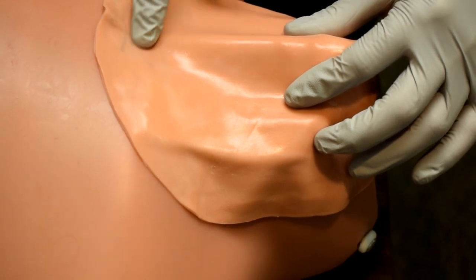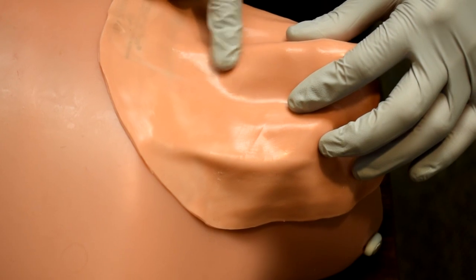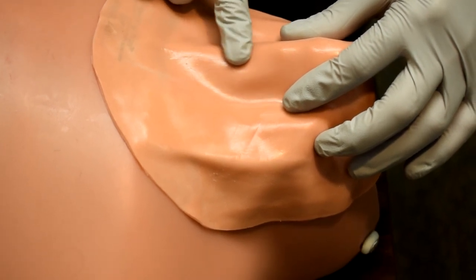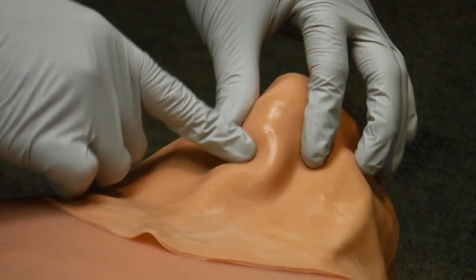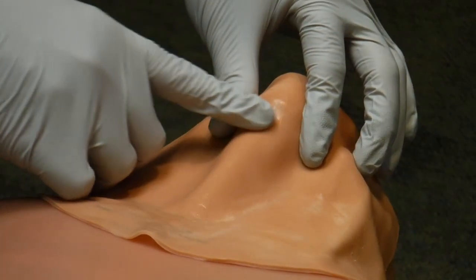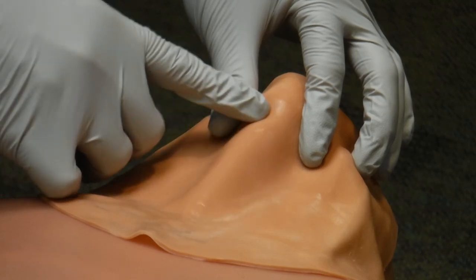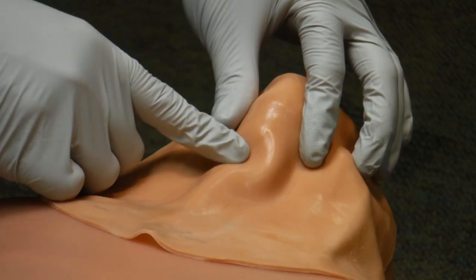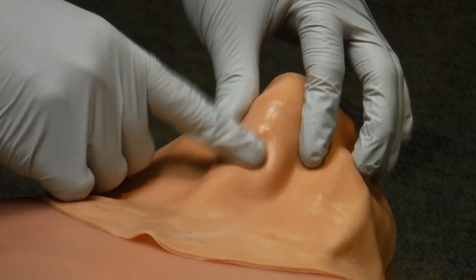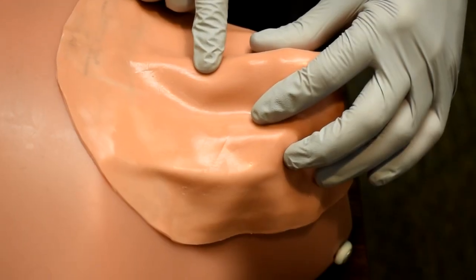Then when you go up from the sternal notch, you're going to feel a soft structure, which is the trachea. Then you're going to feel your first hard structure, which is the cricoid cartilage. Then there's a divot. Then there's the thyroid cartilage. So between the cricoid cartilage and the thyroid cartilage is the cricothyroid membrane. And that is your surgical airway site. It has a nice scaffolding of the two cartilages above and below.